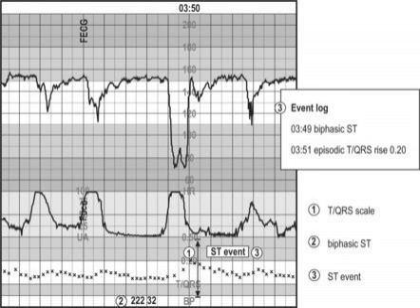What he said was quite right for the time, but in the intervening years, we have gotten together and standardized how we interpret fetal tracings. And importantly, we have incorporated the findings from all these attempts to reduce our false positive rate without the need for further tests. We seem to be stuck with our current paradigm of electronic fetal monitoring, so how can we make it better? Well, first we need to face the fact that maybe we can't improve outcomes for neonates.